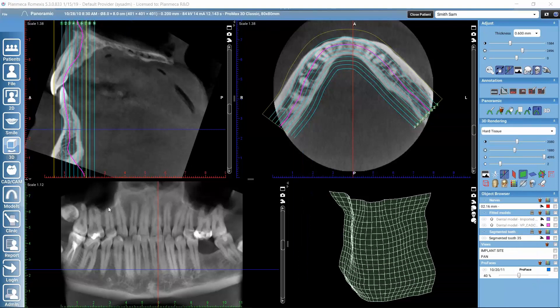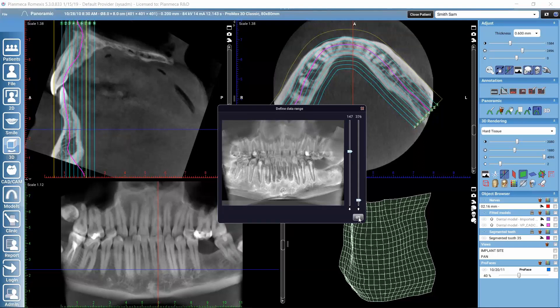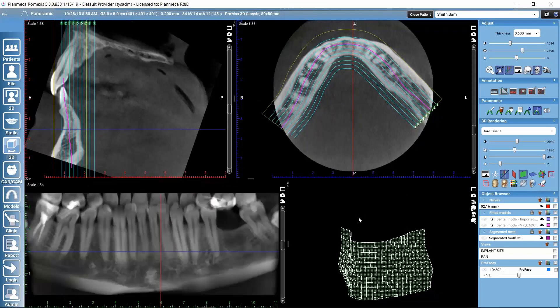We can further adjust the panoramic view by defining the data range. For example, if we are more interested in the area where a tooth is missing, we could hide the upper part of the panoramic curve. Activating the define data range button lets us drag sliders to define the visible area. After clicking OK, the panoramic view gets adjusted accordingly.